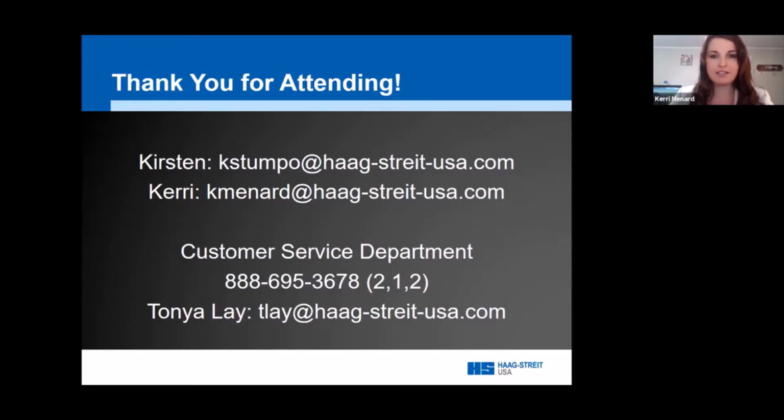So I see some questions in the Q&A. I see that someone's having smiley face emoticons or a frowny face under the measurements. That is a setting that we normally turn off. It is an image quality check, and if you email us, we can help you turn that off in your settings. Essentially, it is indicating if you have all 32 reflection points showing.